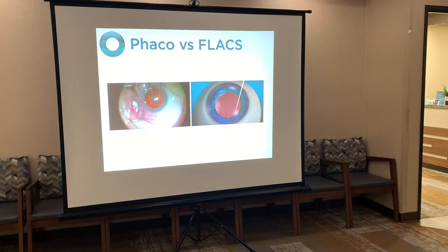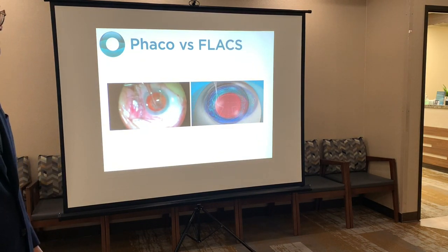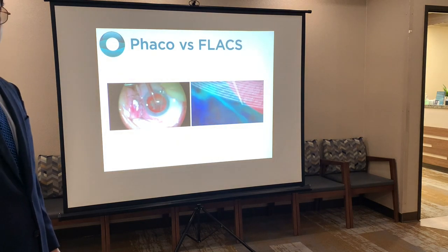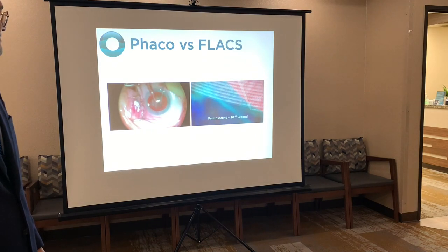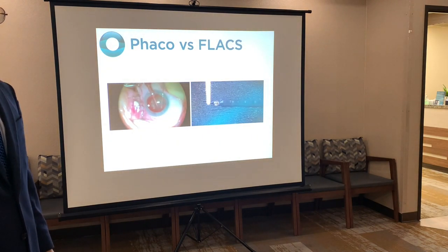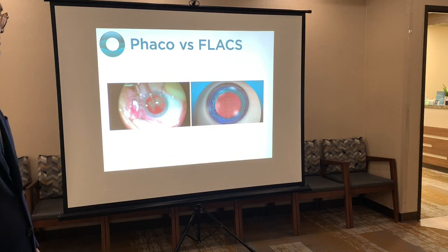Let me play that one more time so you can see that on the left. So using my two hands, I will break each piece up into smaller fragments. And that's how we break it up manually. Each of those pieces then we remove.